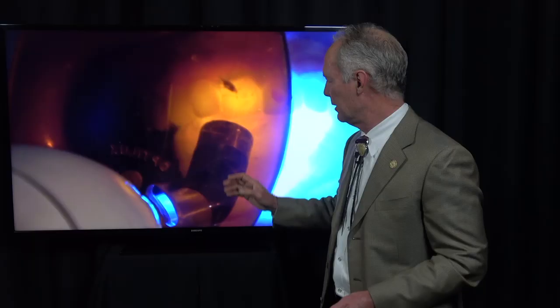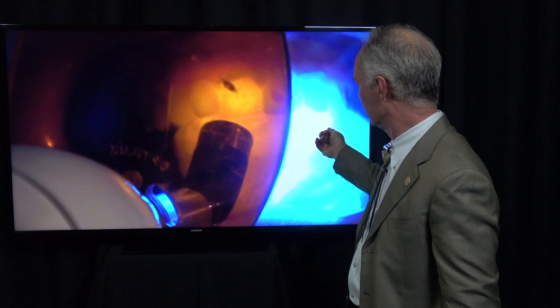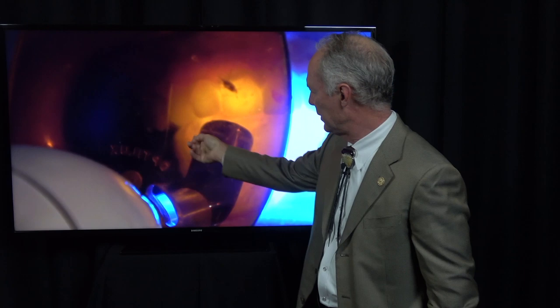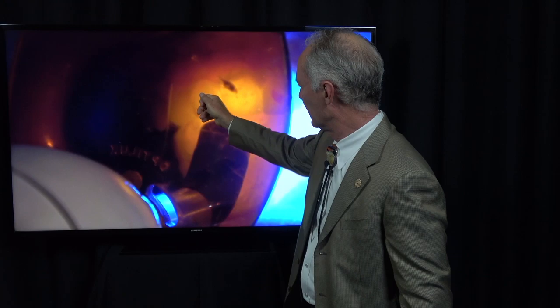This is my Demetron curing light I've had for many, many years. I start on the palatal on the left side, the side away from me, and I go beep, beep, stop. That's about a second. And then I'll come to the facial side, start on the left side and go beep, beep, that's another second. These lights are so effective that cures it initially, so it's crunchy like crunchy snow. That long only. Then the facial, see how long was that? A little over a second.